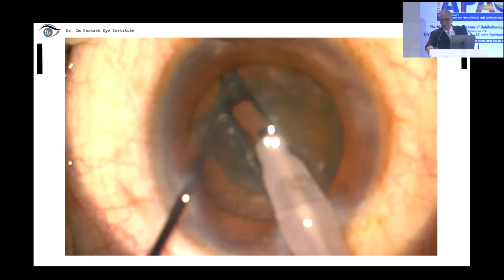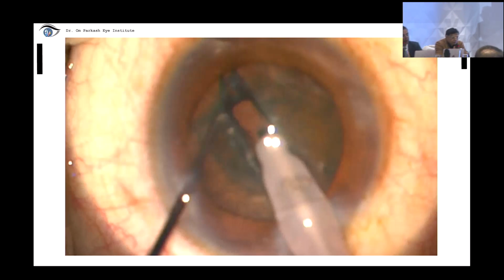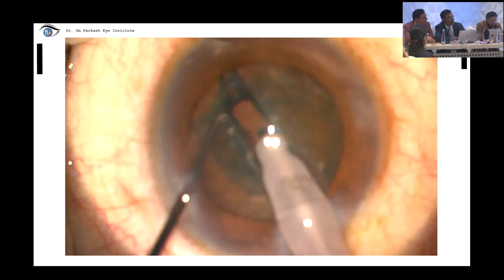So first thing is you have to suspect that there's been a PC break over there. And if you do wishful thinking and you think that I should have got away, I think you should pause, don't switch off the infusion. Keep your infusion on and then start thinking whether, maybe zoom in and see if you can see something broken there. If you can't, then I would actually suggest that, keeping the infusion on, go and inject viscoelastic from the other side port and get your chamber stable. And then try to identify if you actually went into a break.